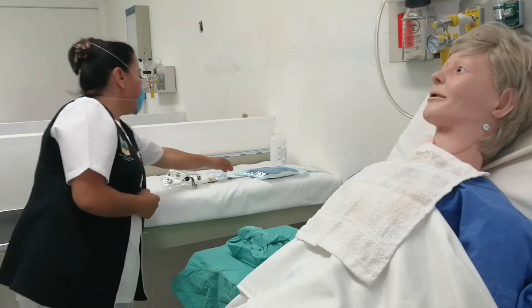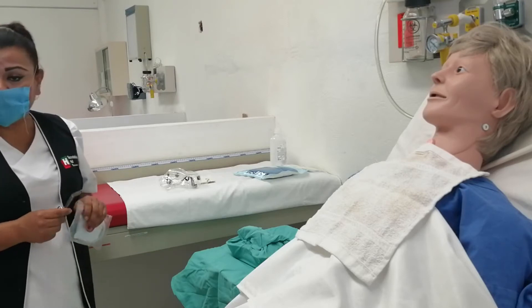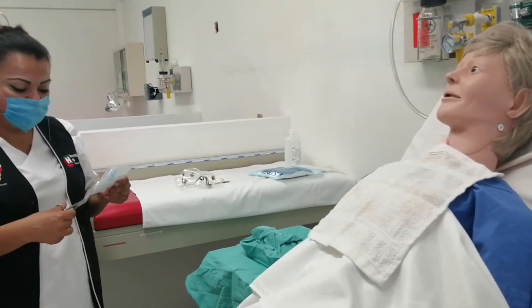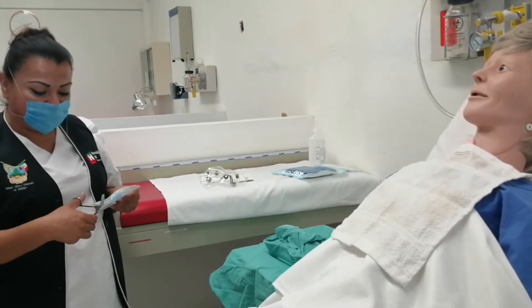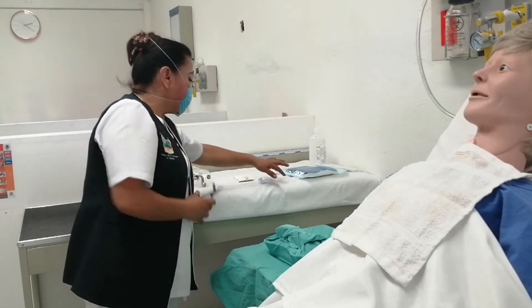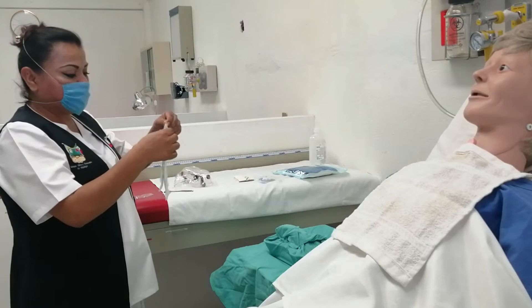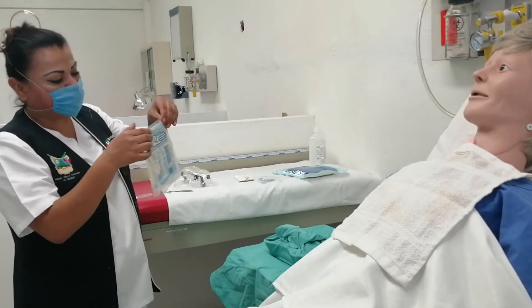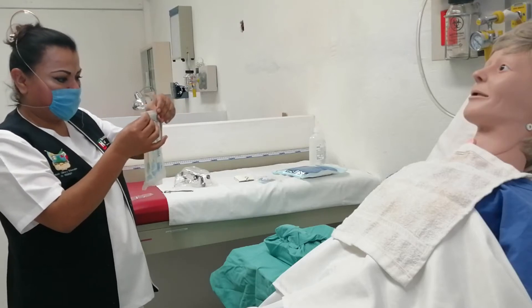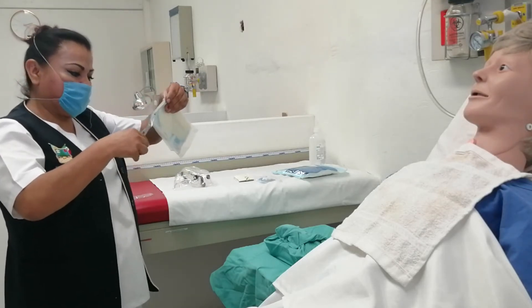Podemos dejar caer todo el material y equipo. Recordemos que esta primera envoltura doble tiene una cara interna estéril, donde podemos dejar caer el material estéril o esperar que una compañera nos asista. Abrimos los guantes viendo cómo vienen para abrirlos de manera correcta. Es muy importante tener una tijera como básico en el equipo.